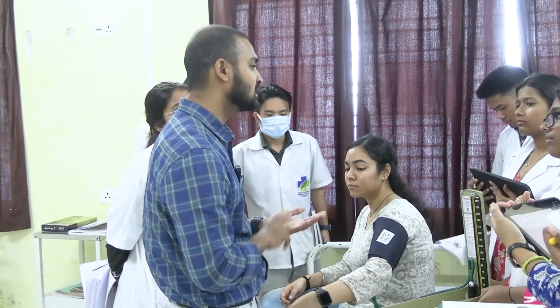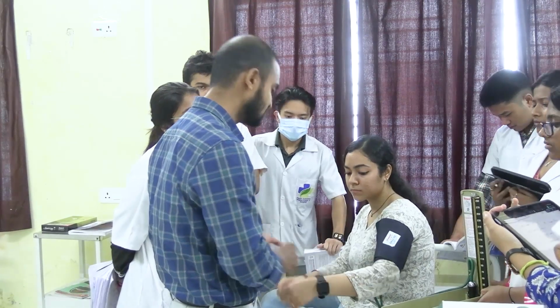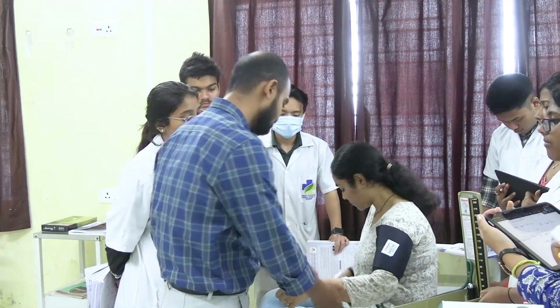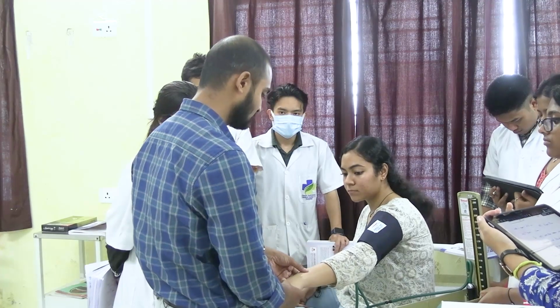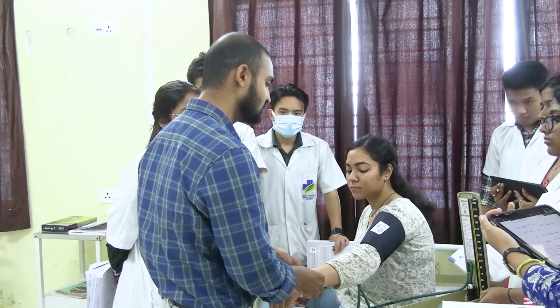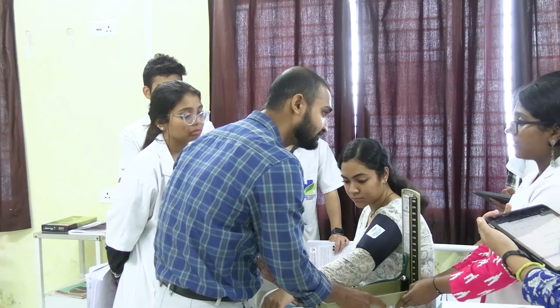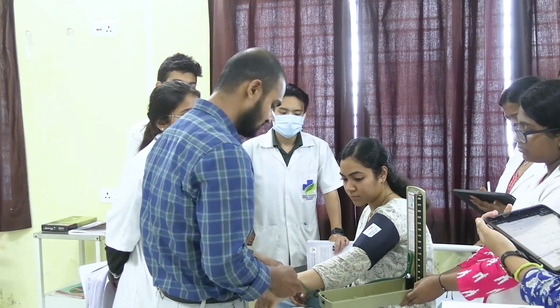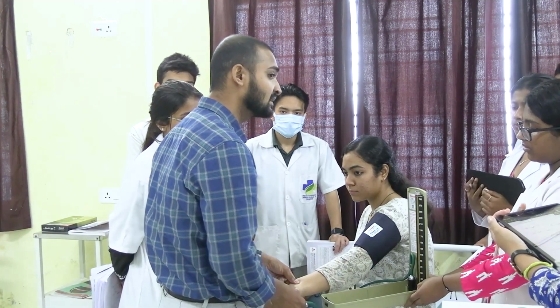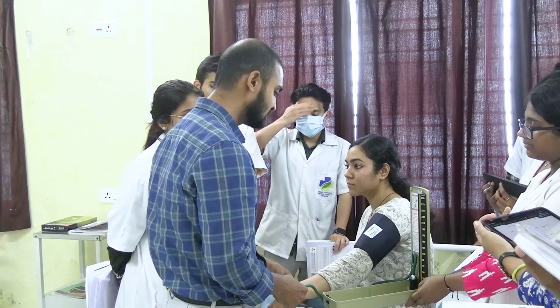First is the palpatory method. Can you open your watch? As you have checked it now, the radial pulse, as we have checked it earlier. So this method we will be using now. Now this is at the level of the heart, and now we are tightening the valve. I am feeling her radial pulse. It is palpating. Now we will slowly inflate the cuff.